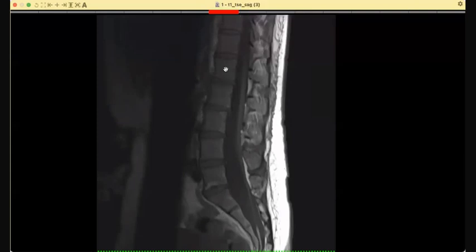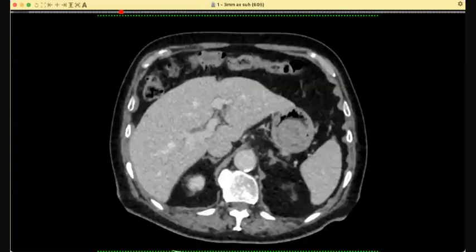Yes. Okay, so this is a 76-year-old male. This patient had some surgery with the urologist. And this is a 1-year follow-up scan. Over to you.